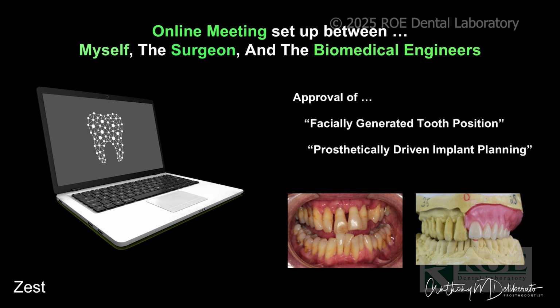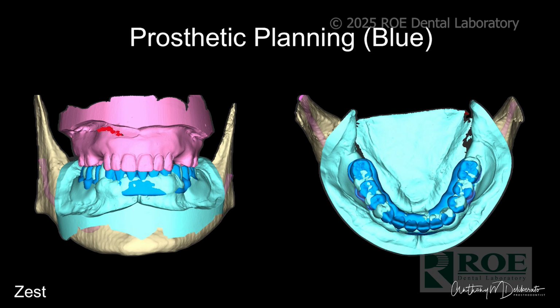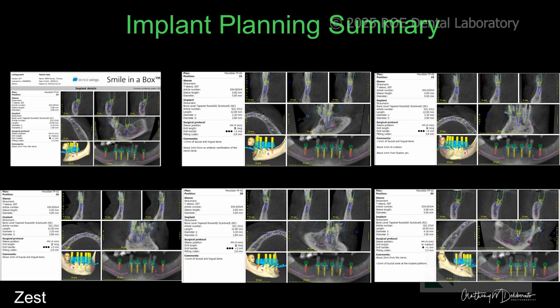And what I just wanted to show is that just like we do immediate dentures, and we use the photos to determine that maybe this patient's teeth were too long and so we're going to change the incisal edge position, we can also do that digitally in our planning. So here's the plan that our designers came up with in order to propose a prosthetic.